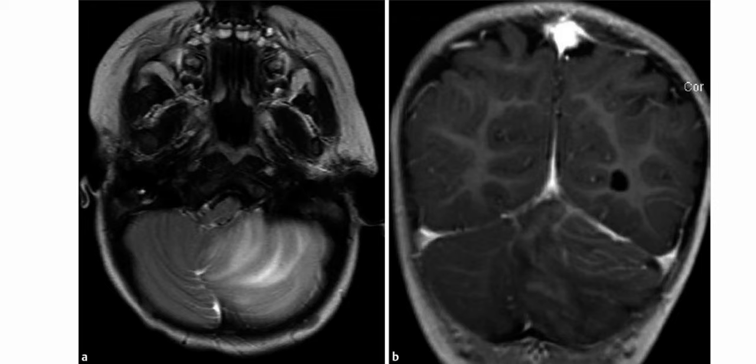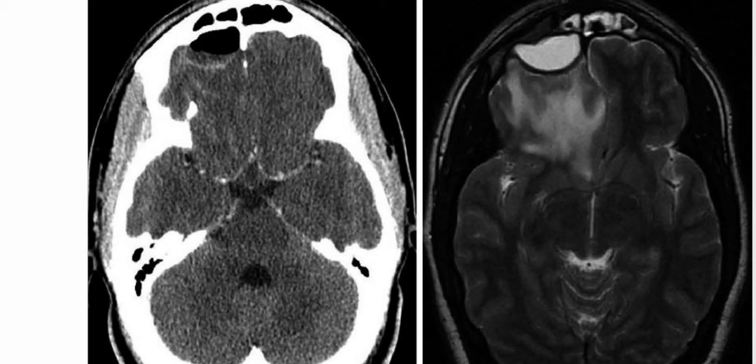So this is a case of Lhermitte-Duclos disease, which is basically a dysplastic cerebellar gangliocytoma of uncertain etiology. So this is another patient presenting with persistent headaches after upper respiratory infection. These are the images on the axial enhanced CT scan.